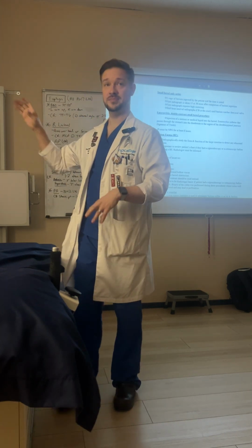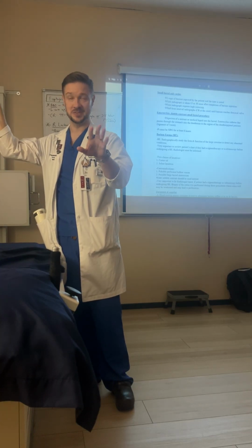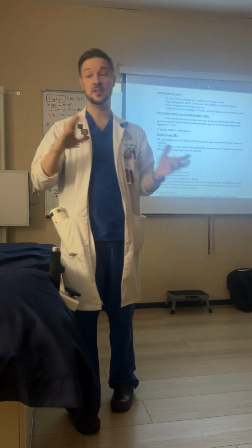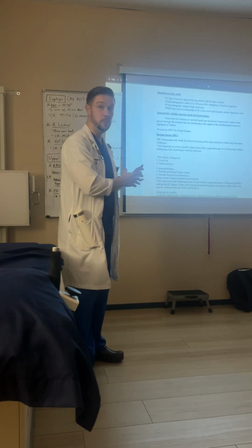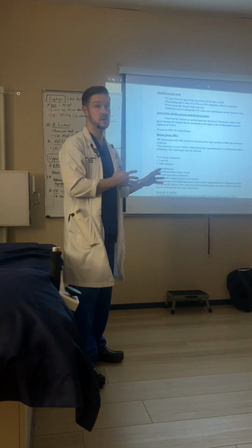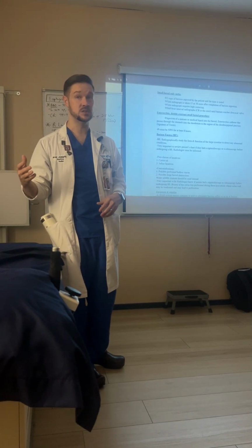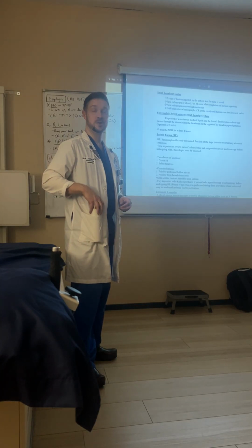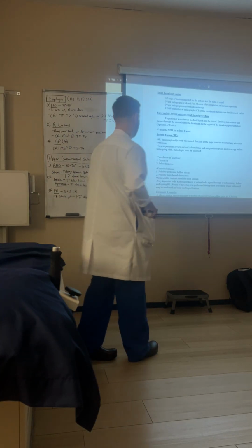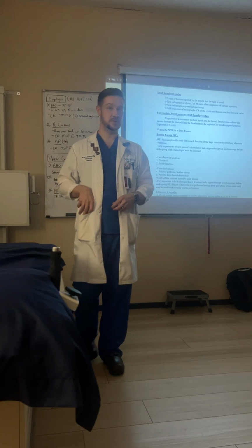The radiologist already left. You're asking a good question, okay? So please feel free to ask questions. We do the upper GI, the radiologist does his fluoroscopic part. Then we move this back. The small bowel portion is mostly radiographs. The radiologist is not going to use fluoroscopy for that, except if he wants to spot the TI. Make sense? Whatever TI is, but yes. Terminal ileum. Okay, gotcha. Great. Okay, any questions on the small bowel procedure?